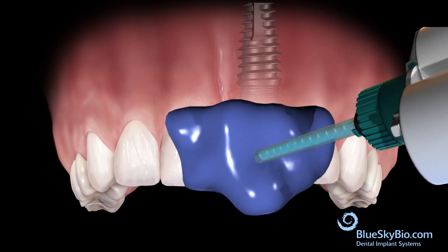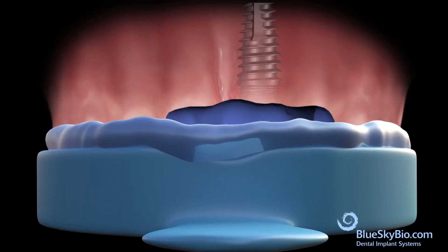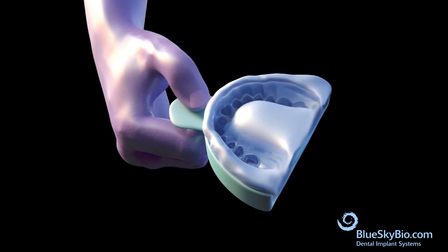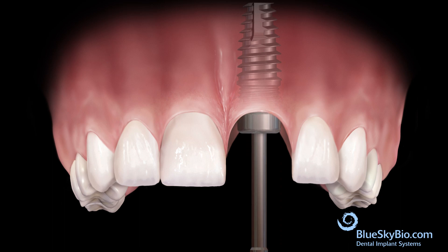Inject medium body impression material around the impression transfer and into an impression tray, then take an impression. After the impression material has hardened, remove the impression. Remove the impression transfer from the mouth. Reinsert the healing abutment.